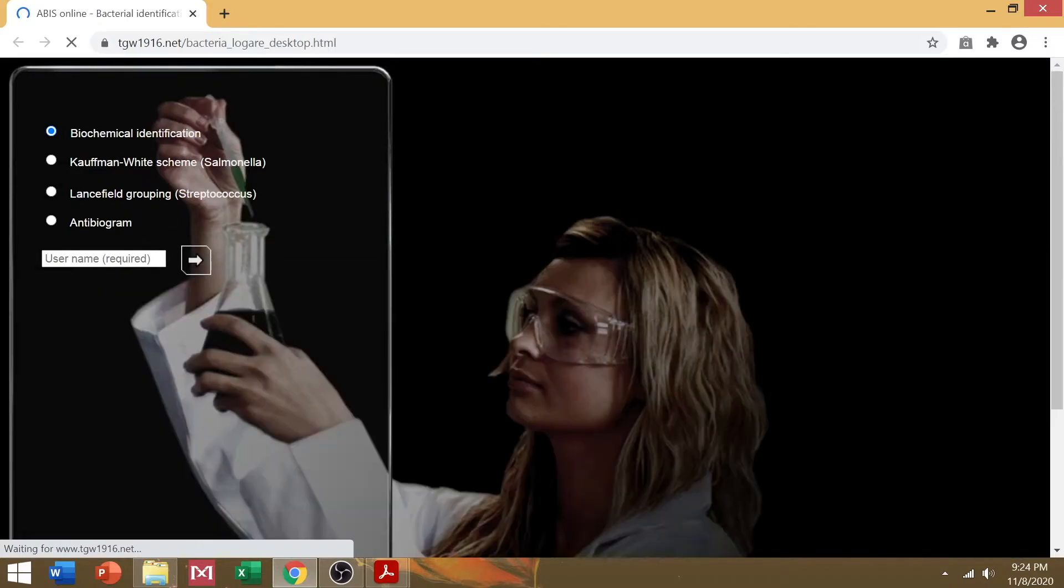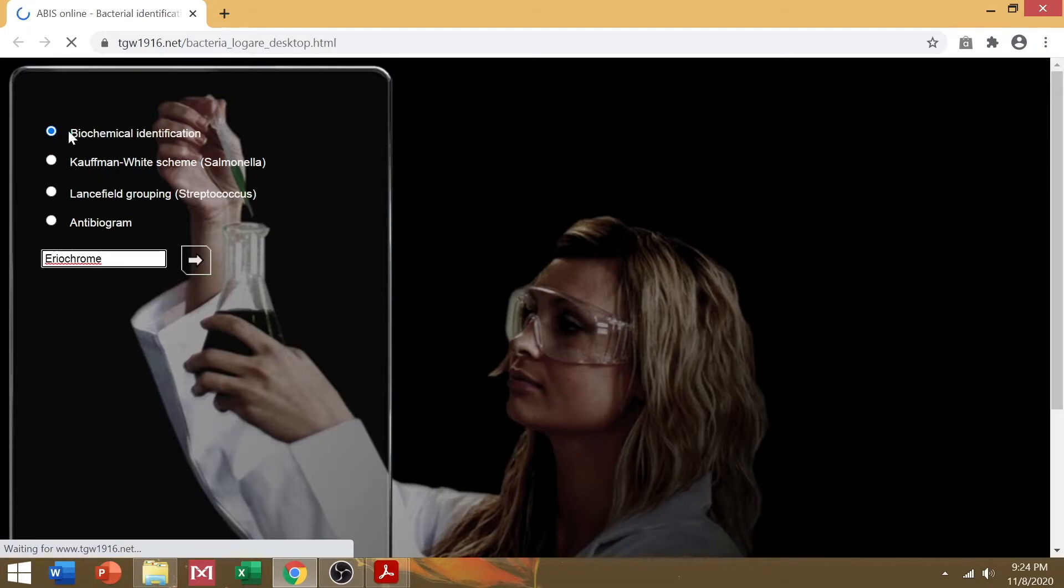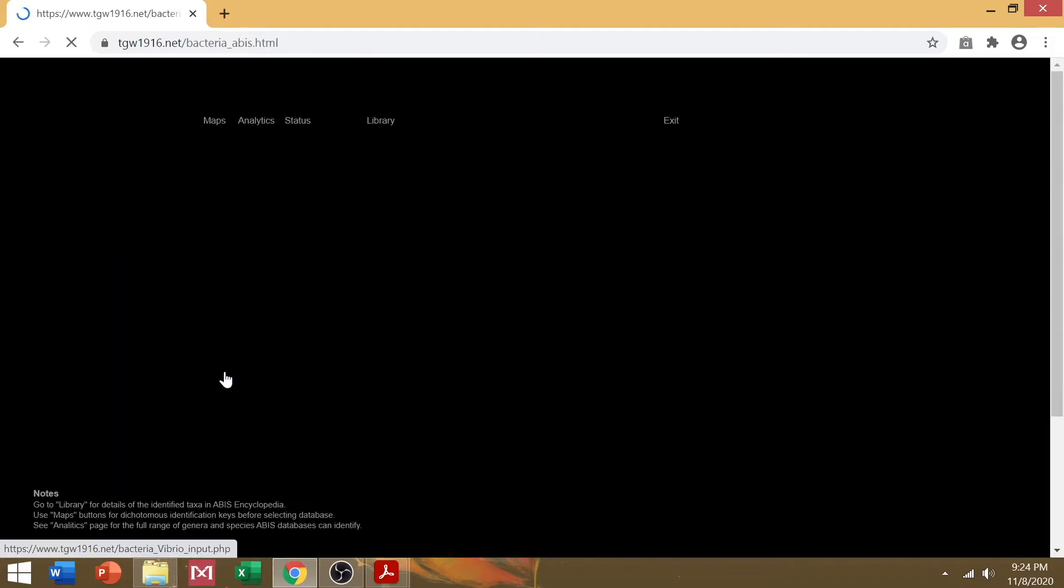And in this website, you need first to input your name. So I'm going to put a pseudonym here, Eriochrome. That's my in-game name too, sometimes. And take biochemical identification and press the arrow to continue.